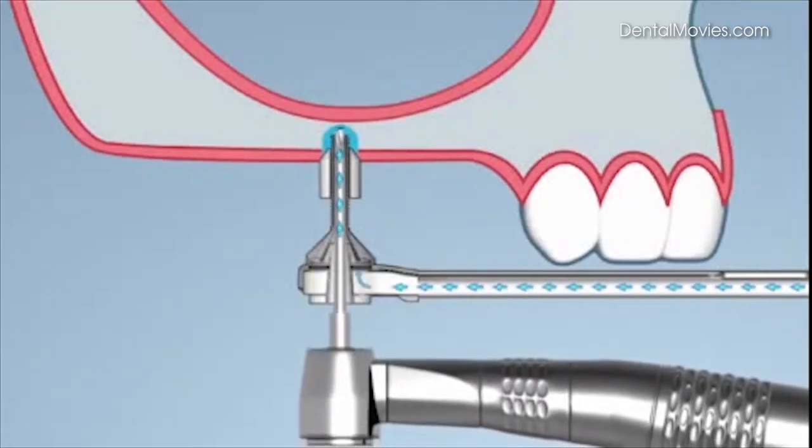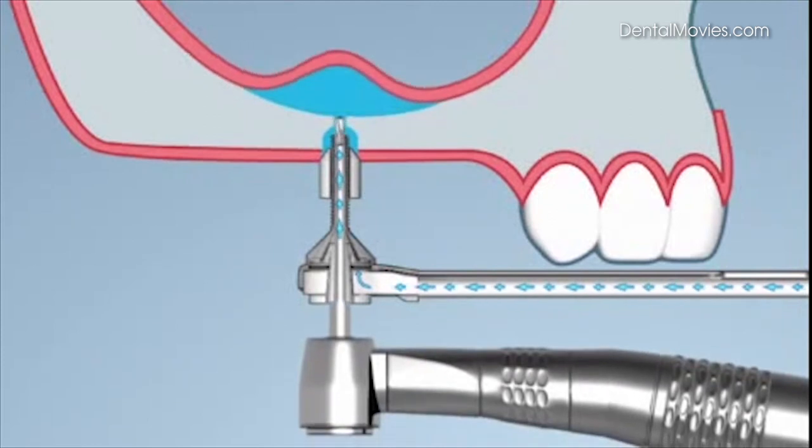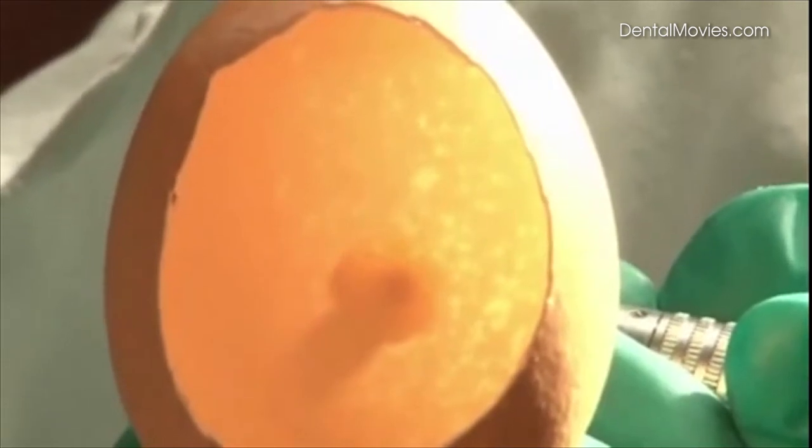The high pressure pushes the membrane away from the drill. The membrane remains unscathed because the drill cannot reach it. The egg model demonstrates how the membrane is pushed away from the drill.